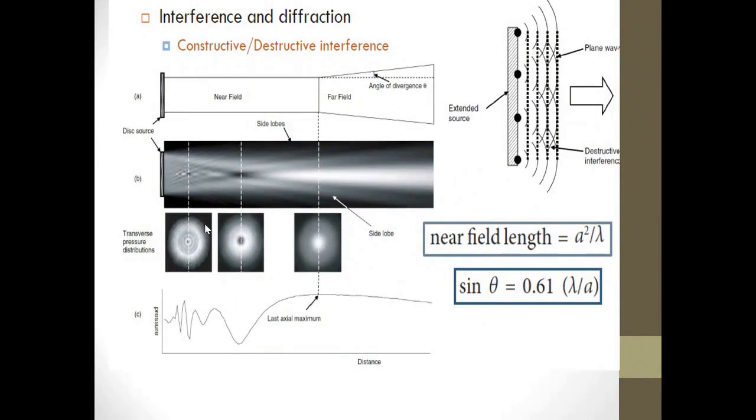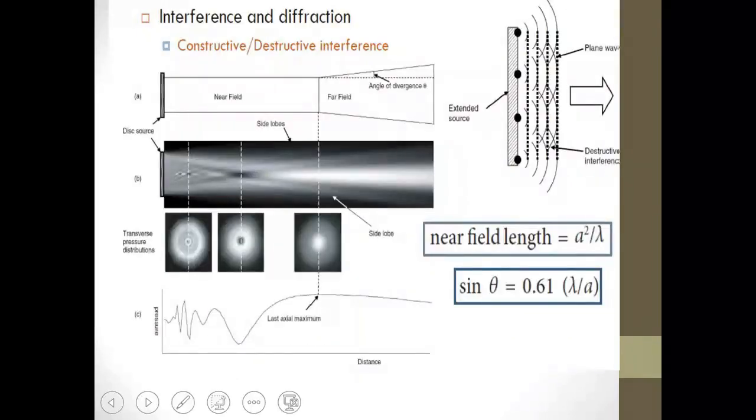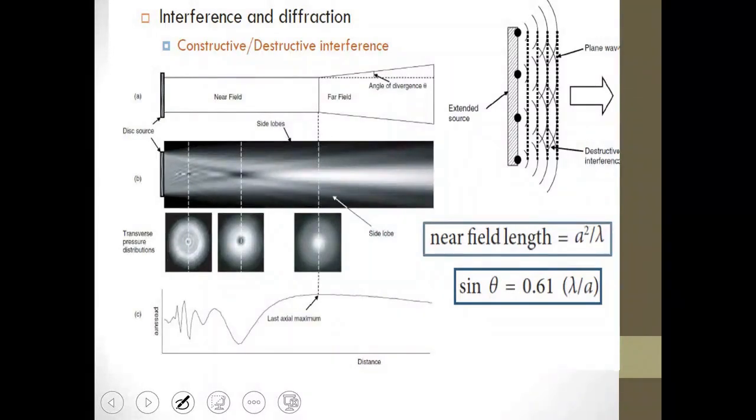Why? Simply because my transducer doesn't have just one crystal. It doesn't have a single element that produces the sound pulses. No, I have a set of crystals, and each crystal produces sound pulses.